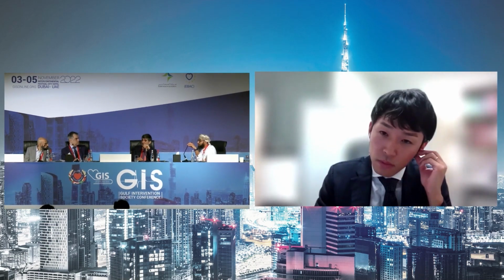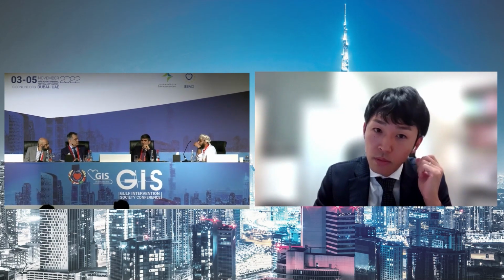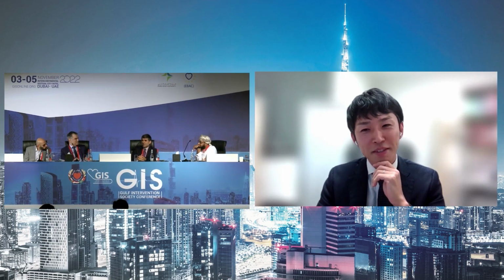No, I think this just shows the importance of intravascular imaging. I have to say that I don't spend too much time measuring the thickness and the length. It just gives you an idea, a ballpark. Once you've done quite a few of these, spending the time measuring whether it's 900 micrometer or 600 micrometer doesn't make too much difference. And we have to remember this is a high resolution. Even the slightest movement of your cursor might give you a different number.